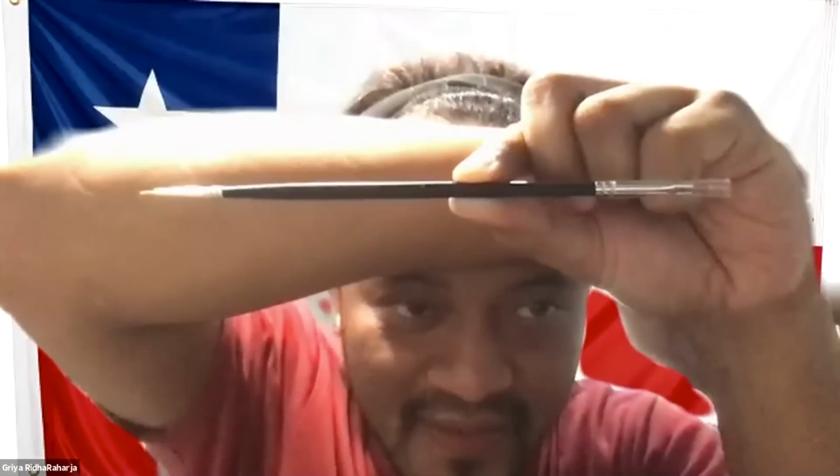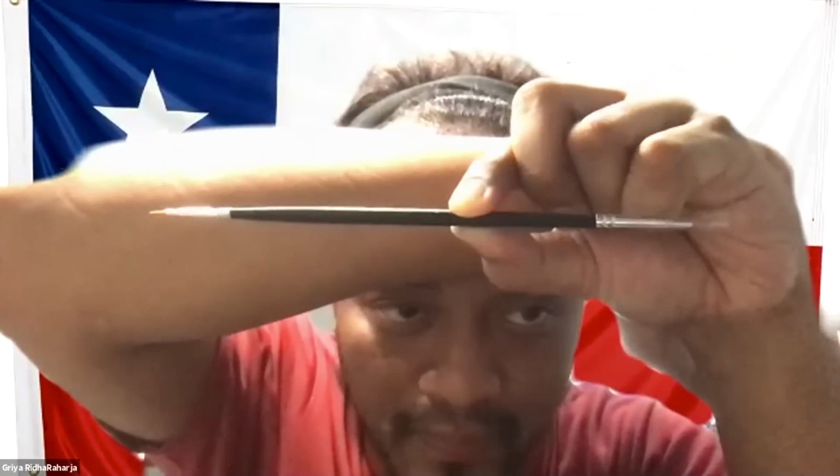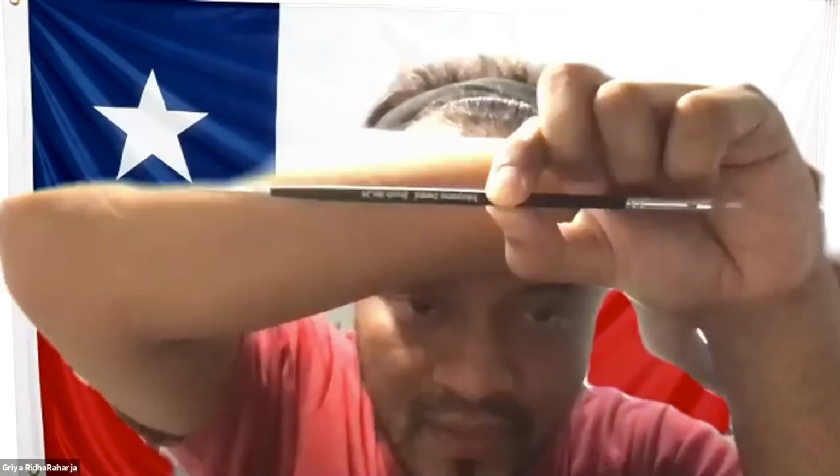See? This is tapered, and the other is pointed, square. It's called the Tokuyama brush, Tokuyama dental brush number 24. But if you don't have a Tokuyama brush, you can use a painting brush with small tips.